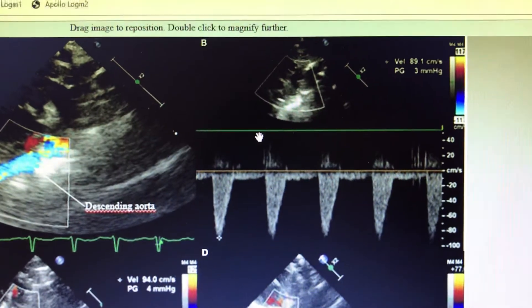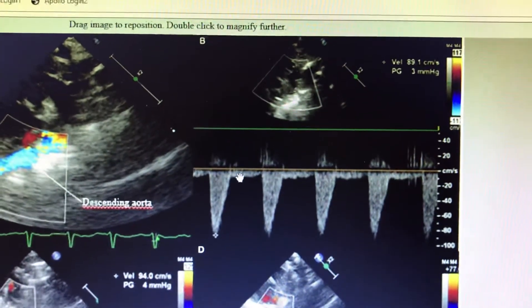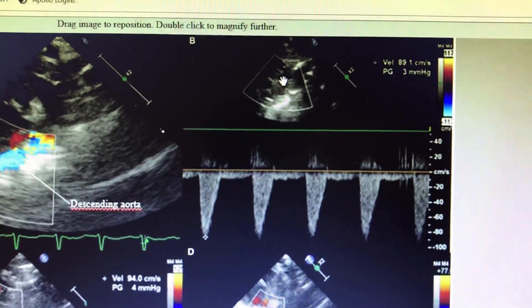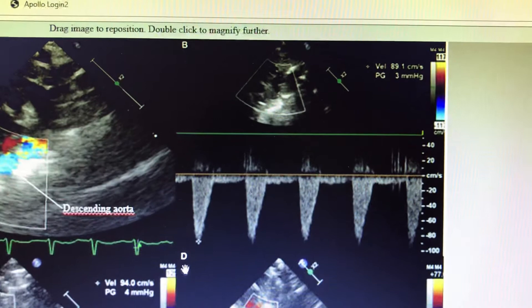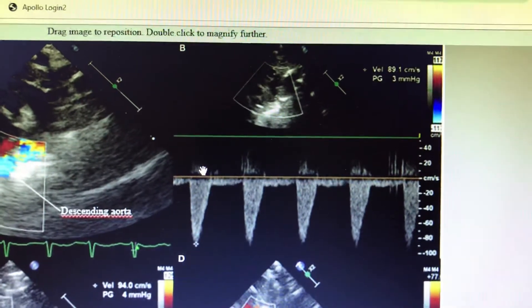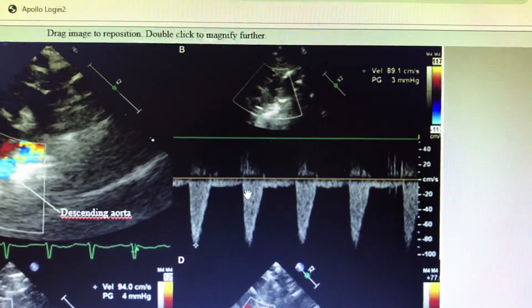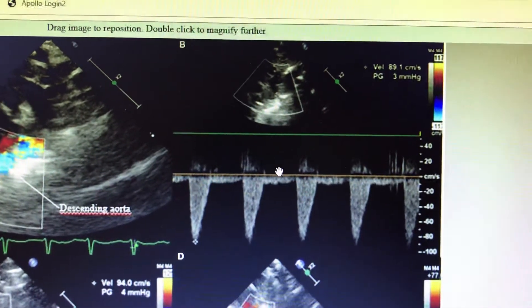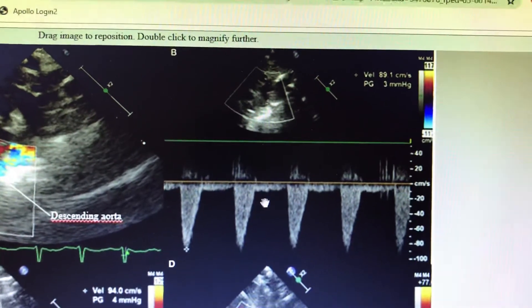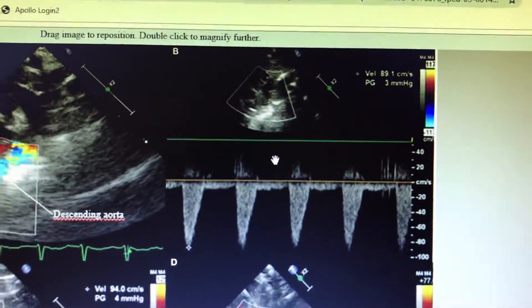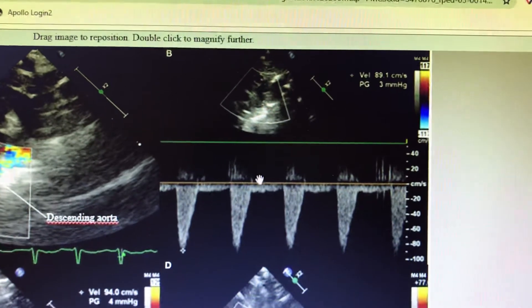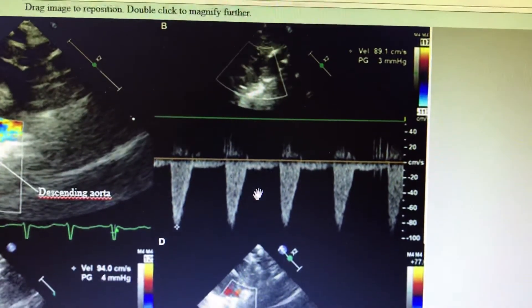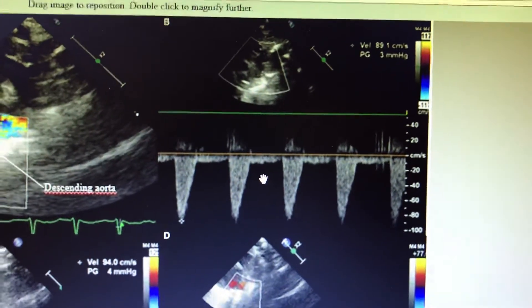Now they put the cursor on the descending aorta, distal to the PDA — that is very important. See that in a normal case, even if you put the cursor on the arch of the aorta, you will see that this is the systolic flow in the aorta and there is a slight diastolic flow also. This diastolic flow is forward, not backward, because at any point in the cardiac cycle the blood will never flow in the backward direction. But there is another condition where you will get diastolic flow reversal or retrograde flow, and that is in the PDA.